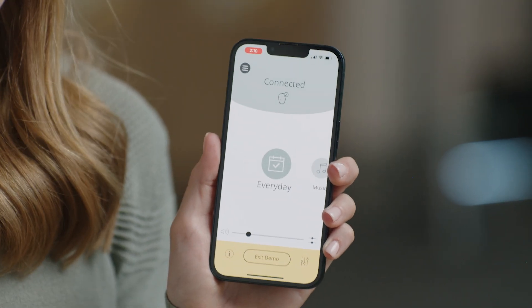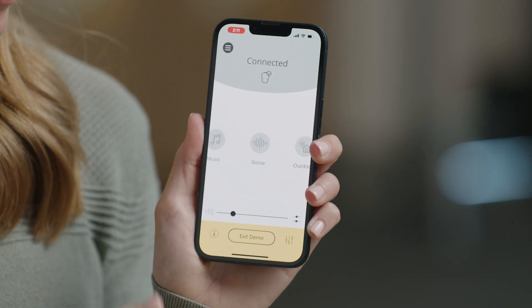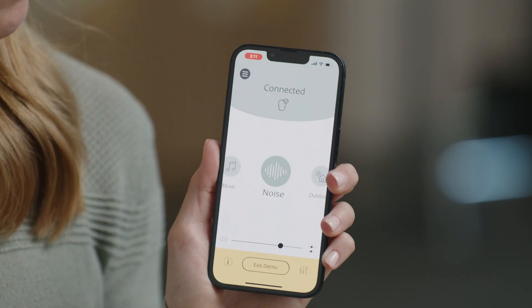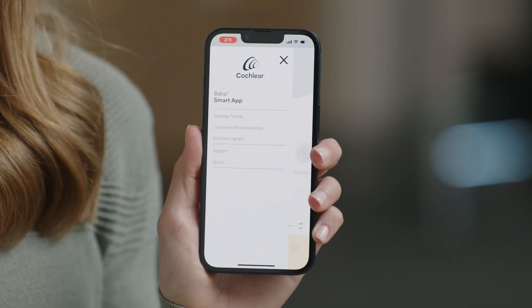If you have multiple programs on your sound processor, above the volume slider you will see multiple icons representing different programs. Select the icon to change these programs. Under this menu, you'll find more information, including detailed steps on how to pair your accessories.